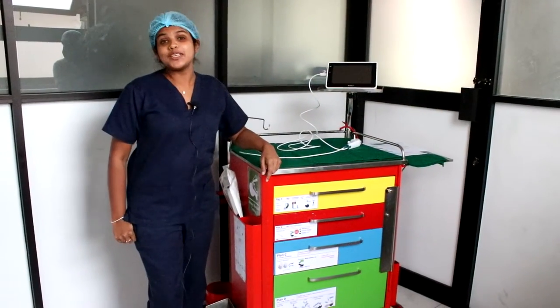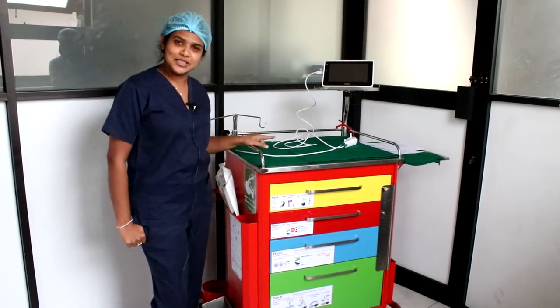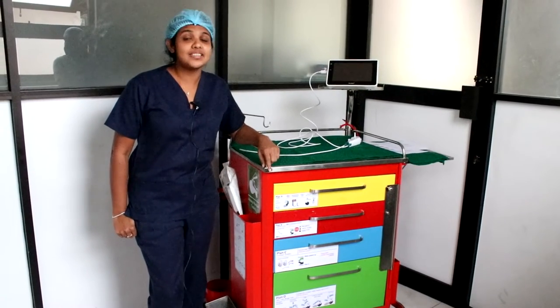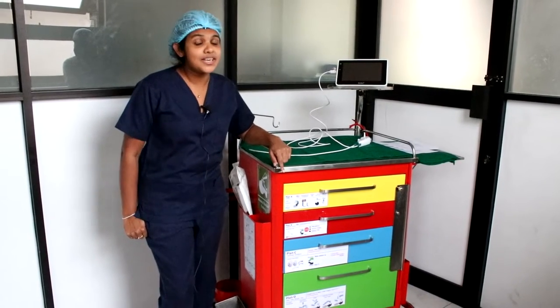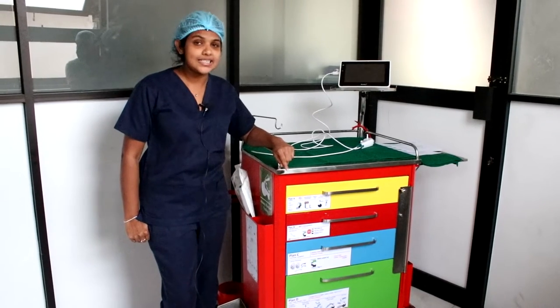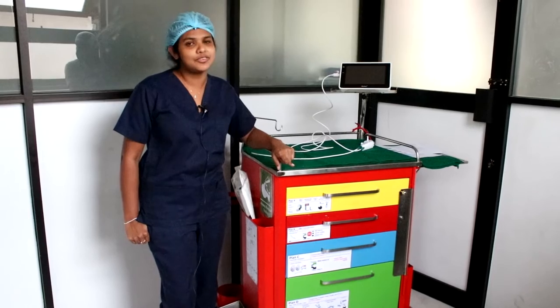Hello everyone, today we are going to get ourselves familiarized with the difficult intubation trolley. We all know that difficult intubation or failure to ventilate can end up with mortality. Hence it's really important to have prior preparation to manage anticipated as well as unanticipated difficult airway.